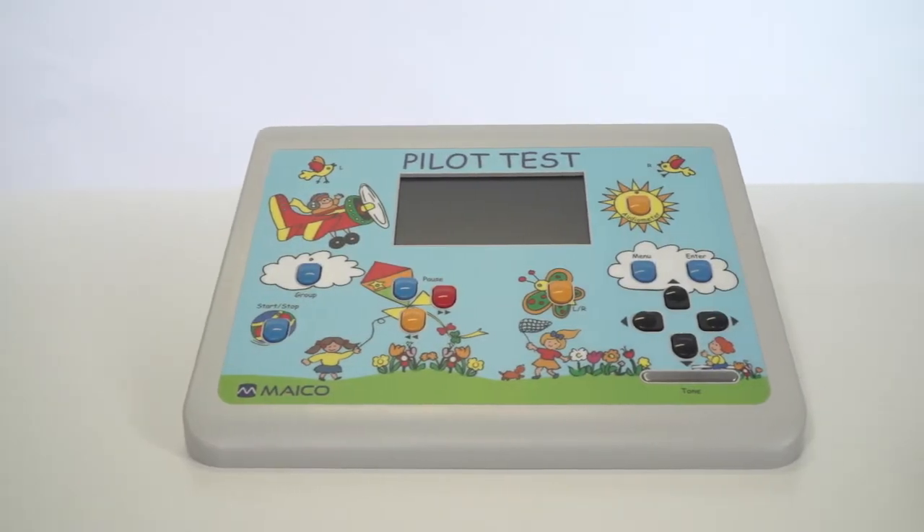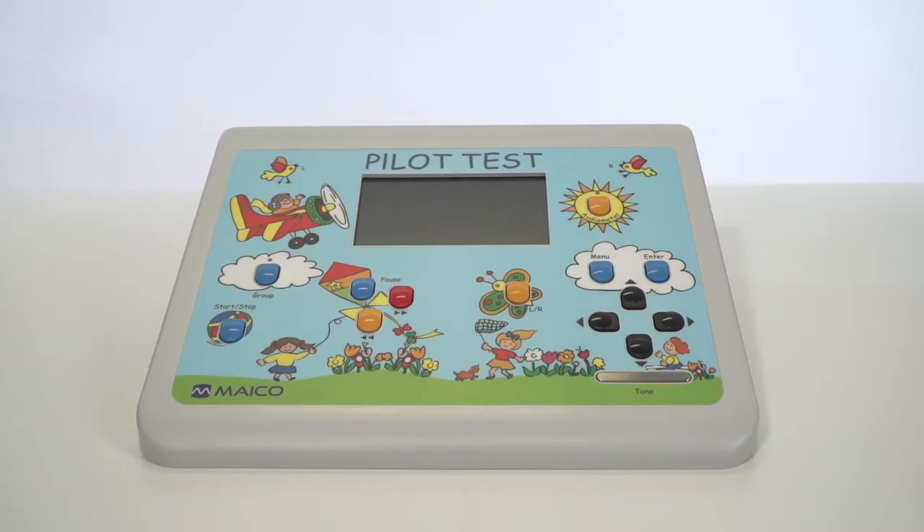This demo is to show you how to set up and use the MAICO Pilot Test audiometer. The Pilot Test offers two test options: pure tone audiometry and select picture audiometry.